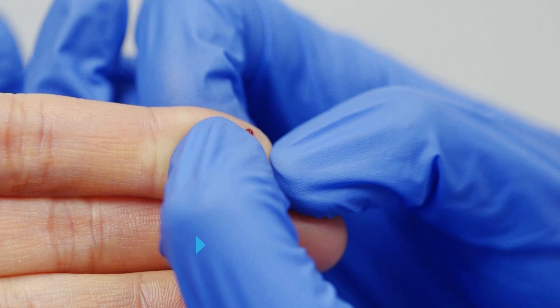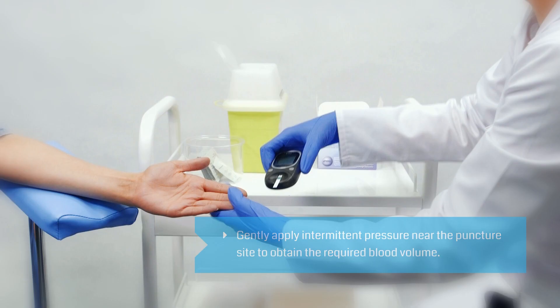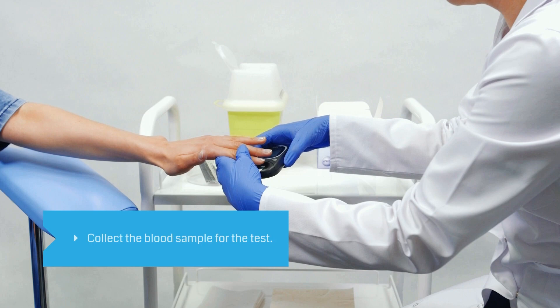Gently apply intermittent pressure to the finger near the puncture site to obtain the required blood volume. Collect the blood sample for the test.